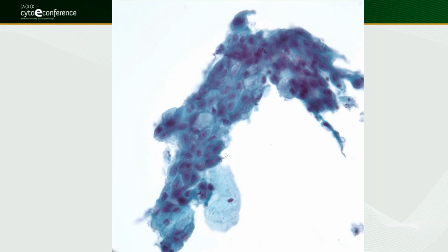And so again, like I said before, it's important to not call everything atypical endocervical cells, NOS. This is a reactive repair picture when it's still a flat sheet.